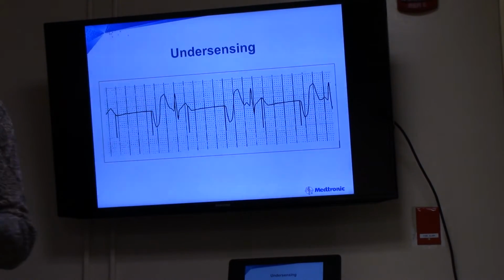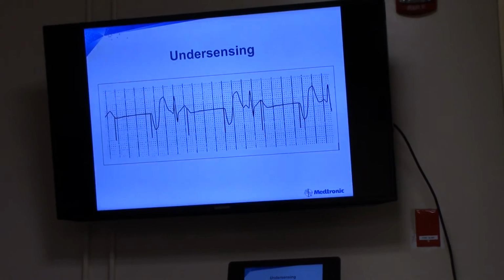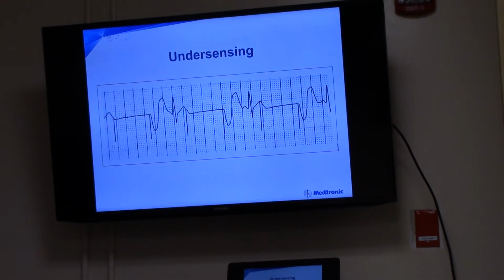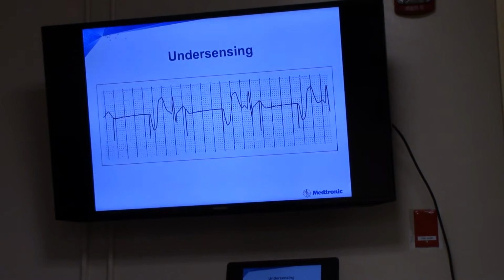In order to do that, first you may be locked, so unlock your pacemaker, and then on the bottom you'll see a ventricular sensitivity setting. To make it more sensitive, what am I going to do to my number? Go up or go down? More sensitive. Am I going to raise my fence or lower my fence? I'm not seeing what I need to see, so do I need to lower it? Lower it. Yep.